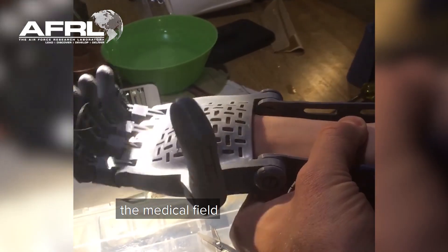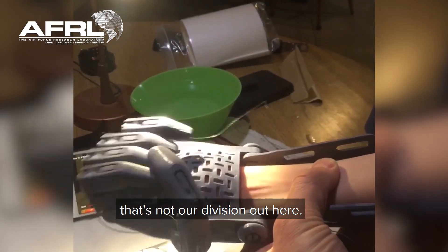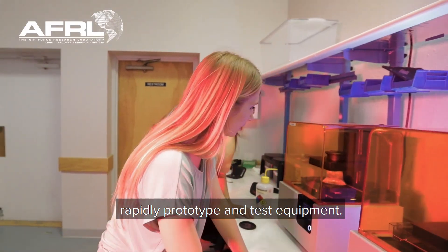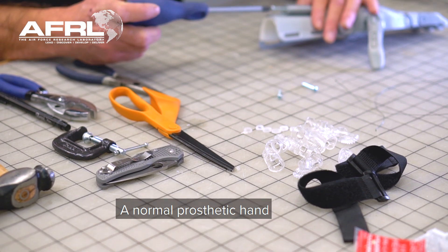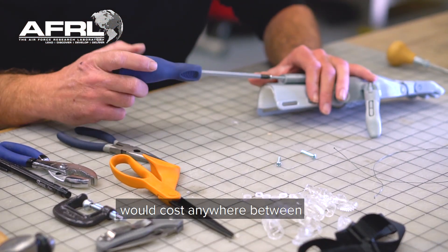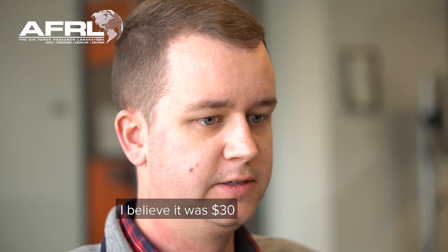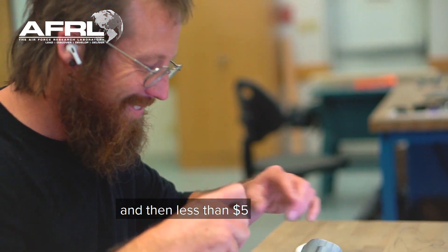We're not really trying to get into the medical field — that's not really our division out here. We just have access to the tools and capabilities to rapidly prototype and test equipment. A normal prosthetic hand would cost anywhere between $10,000 to $15,000. With the power of 3D printing and the cost of filament, it only cost us about $30 in equipment and less than $5 in plastic.